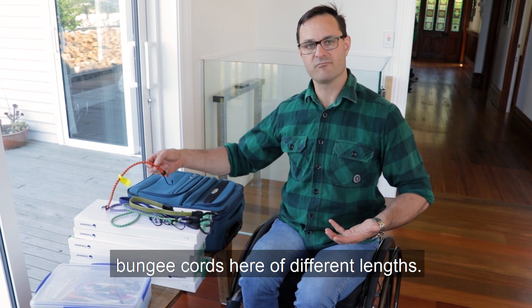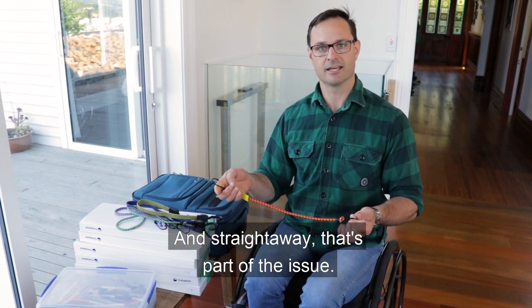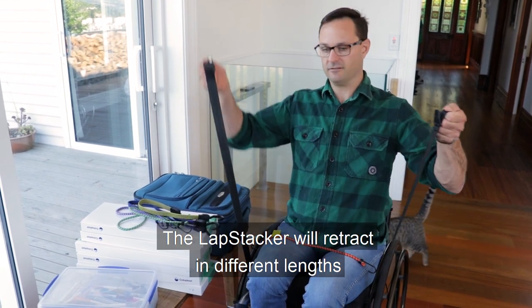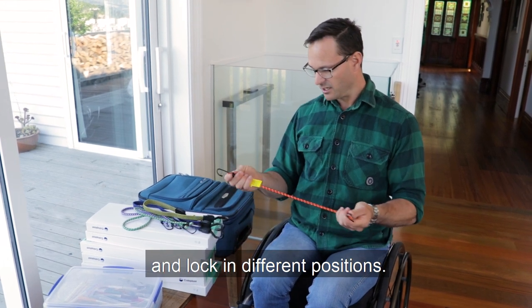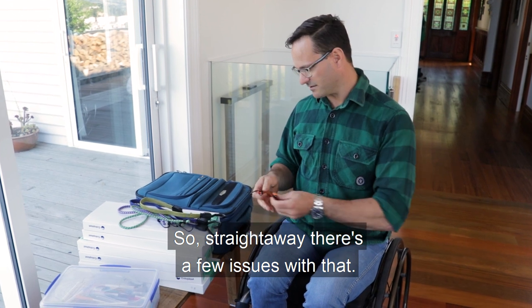So I've got a variety of bungee cords here of different lengths. And straight away that's part of the issue — the lap stacker will retract in different lengths and lock in different positions. For a bungee it's a fixed length, so straight away there are a few issues with that.